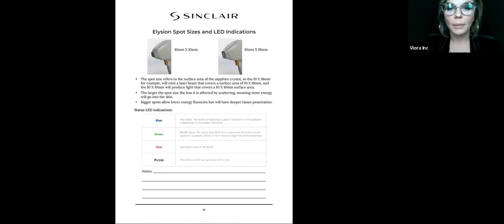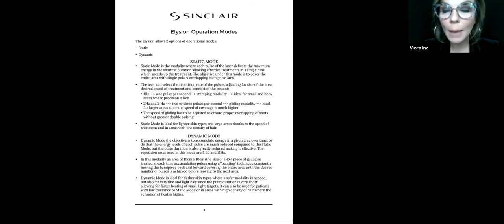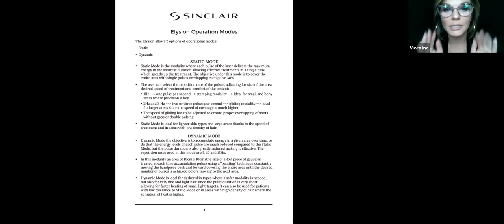Okay, so we have two operation modes with the Elysion. We have the static mode and we have the dynamic mode. Please note, static mode is going to be great for your skin types 1, 2, and 3, and additionally, sometimes skin type 4. And the dynamic mode is going to be great for your skin types 4 through 6. So for skin types, static 1 through 3, sometimes 4, dynamic skin types 4 through 6. When you would use dynamic on a lighter skin type is for comfort. I'll talk about that in just a bit. First, we'll talk about static mode.